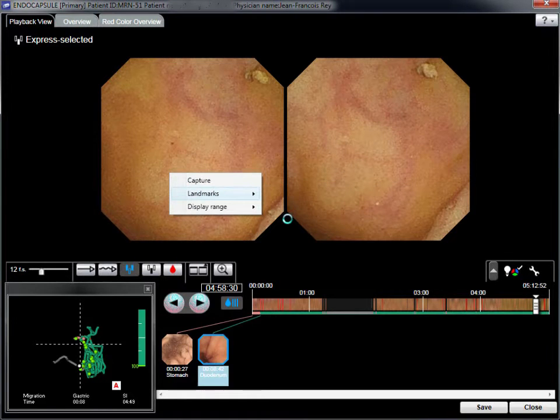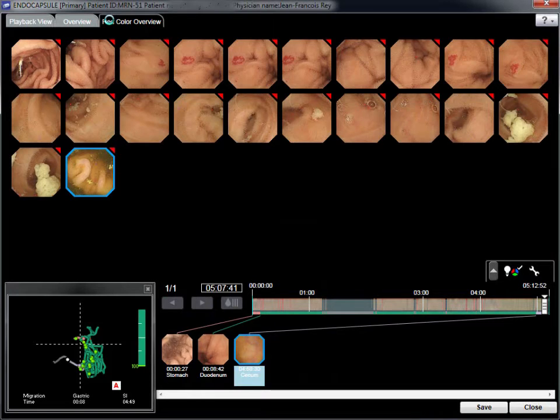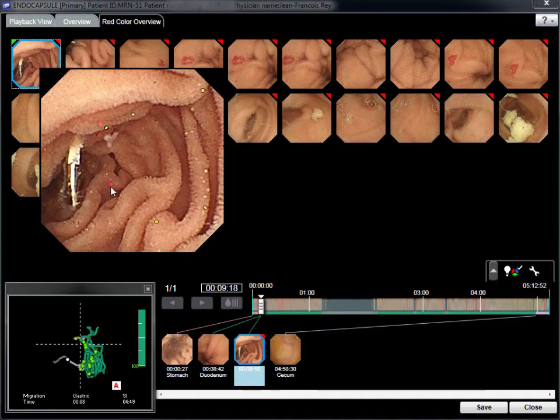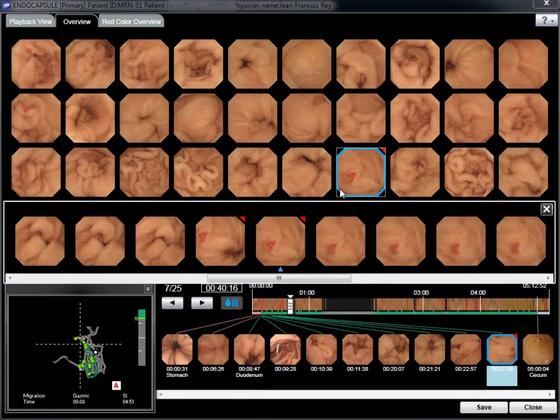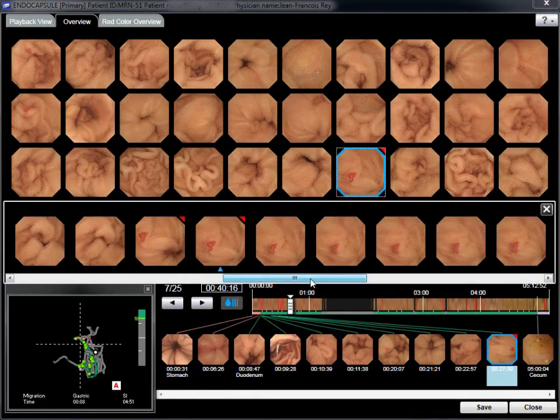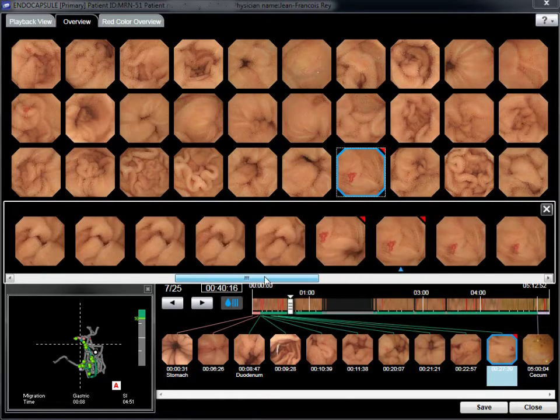The final landmark, the first image of the cecum, sees the completion of the 3D tracking image. A quick glance at the red colour overview allows the first diagnosis of an angioma. The enlarged image shows a hemostatic clip from a previous enteroscopy. A jejunal angioma is clearly identified on the enhanced still image, which can be stored with the capsule aspect on the lower part of the screen.